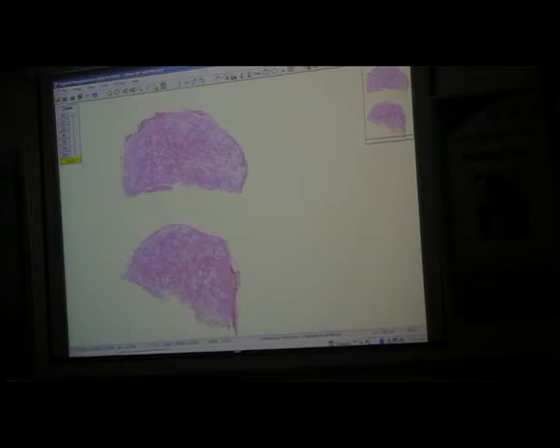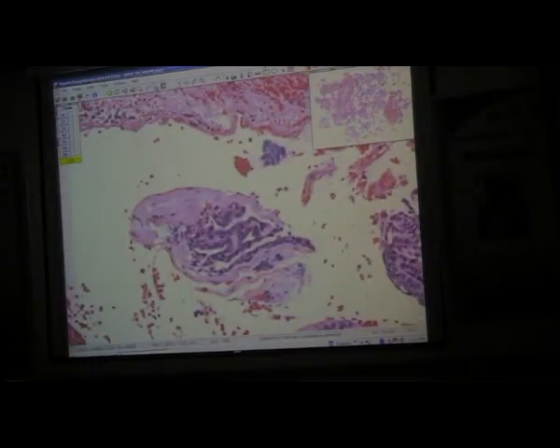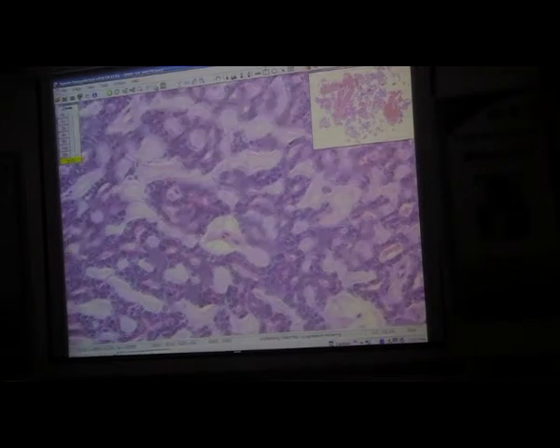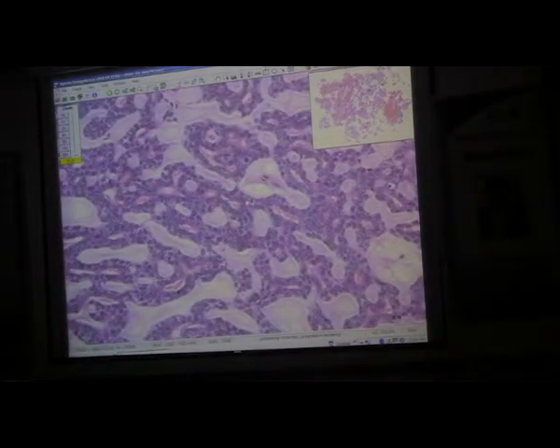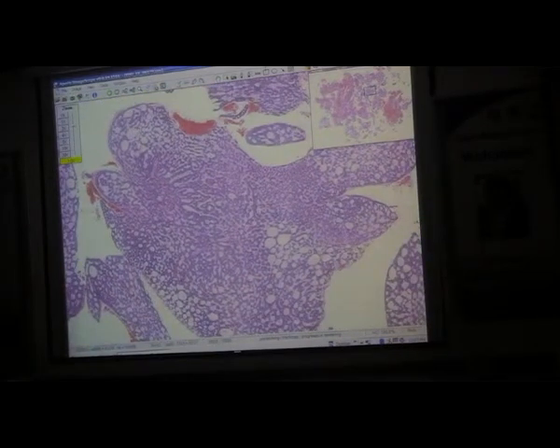Just show me with your fingers what you expect to see, and if I am fortunate about this, and I am not, that's what you see. All of the fingers coming out at you. That's okay? If we go and look at this under a higher magnification, you can see it looks like Swiss cheese, has a tendency to invade nerves, adenoid cystic carcinoma. That's okay? Alright.